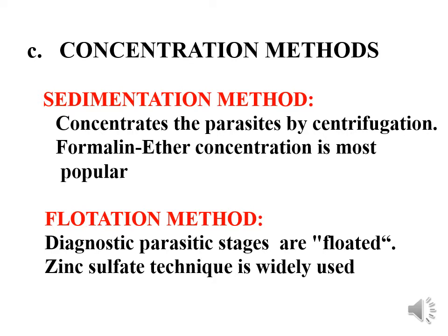If ether is used, you have to keep it away from any flame, because it is easily inflammable. In this case, you mix the stool specimen in the formalin ether, and then you spin it and decant the supernatant, and then you can add another formalin ether. You also spin it up, and then you decant until you have a clear sedimentation at the bottom of the tube. Then you can take that sedimentation, put it on a slide, dry the slide, and later on you have to stain. So it's a longer procedure, but it enhances the possibility of catching mild infections.